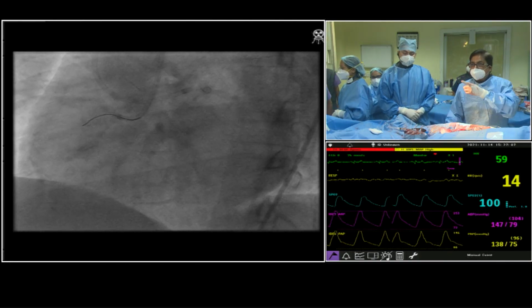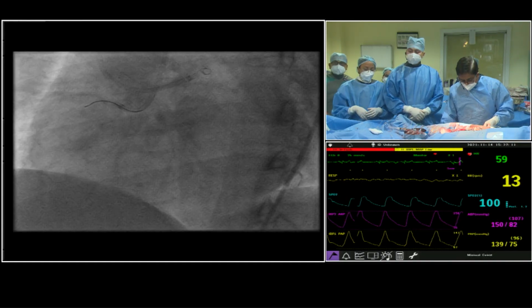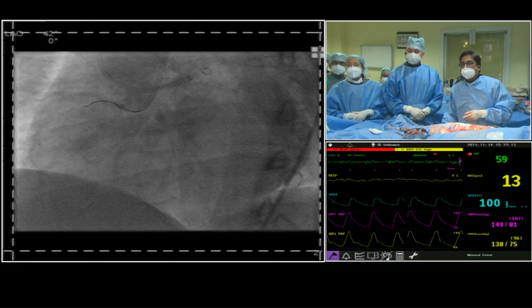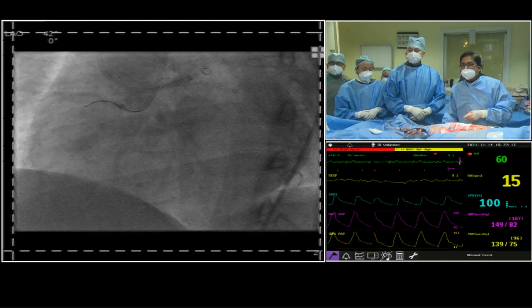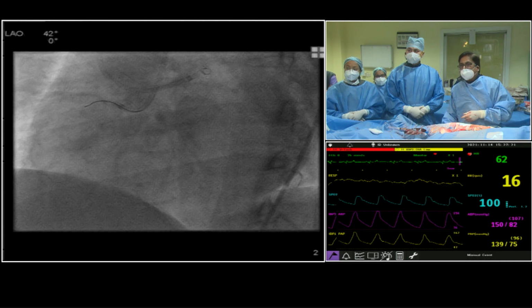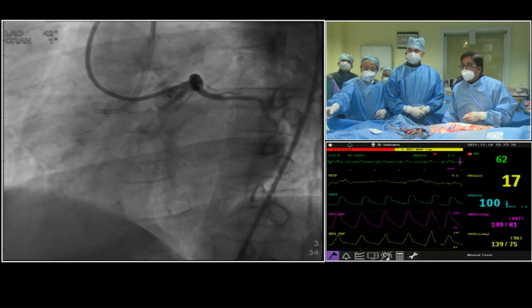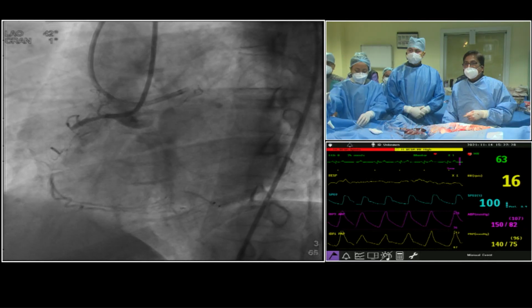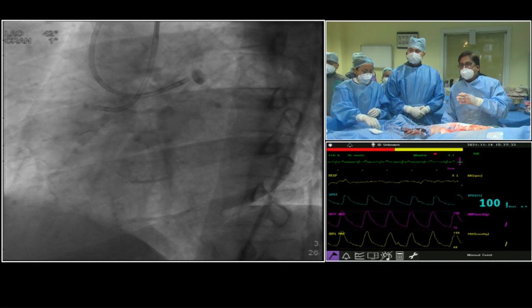Professor Goel, this is Aftab here. Can you just, for the purpose of learning, I think it's a tough case, and especially we don't see much of interventional collaterals from the left. That's what at least we can see on the screen here. Yes, correct. So your comments on antegrade, your assessment of the antegrade proximal cap?